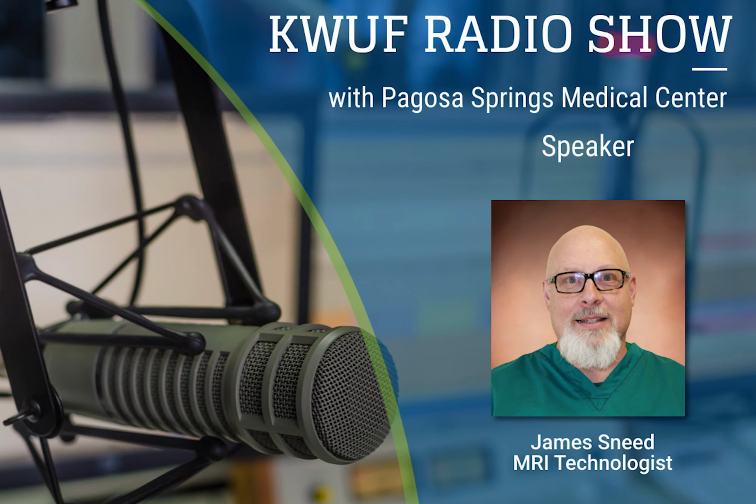Yeah, they're all there, everything you can imagine. So you switch those out depending on the patient's needs. And we deploy the antennas based on what our protocol is for scanning.